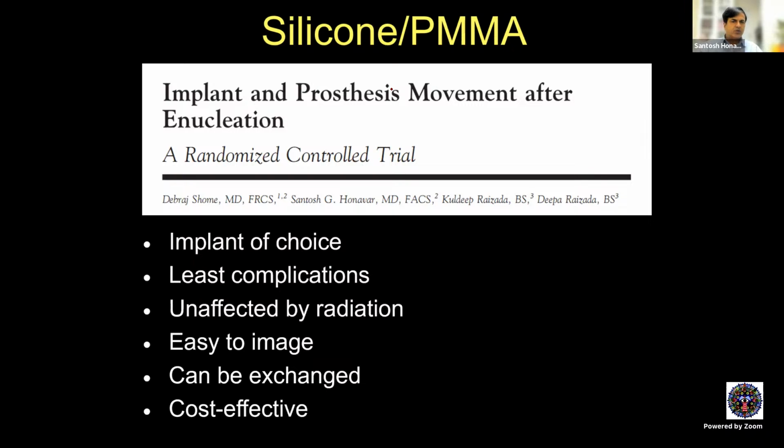Least complications, they don't easily get extruded. They're not affected by radiation. There is a study which has showed, in fact, the study used water baths in which each implant was immersed and usual dose of external beam radiation was given, and the biological nature of the implant following irradiation was studied. I think it was done by Karcioglu, and he found that there was absolutely no change at all, not even in a well-cured PMMA implant. There was not even release of monomers following radiation. That means that these implants are non-toxic and remain non-toxic despite radiation.